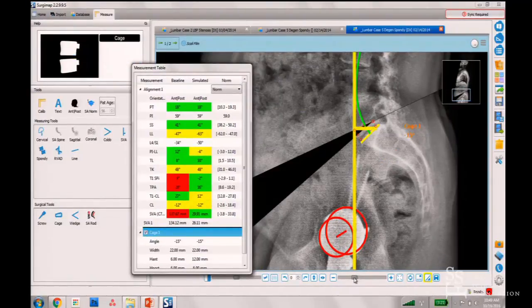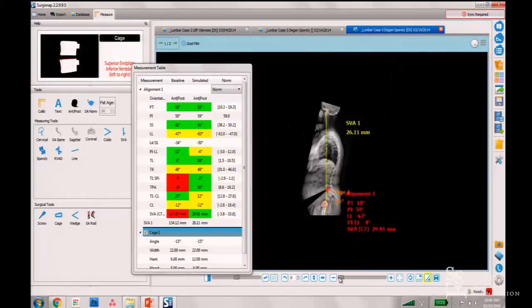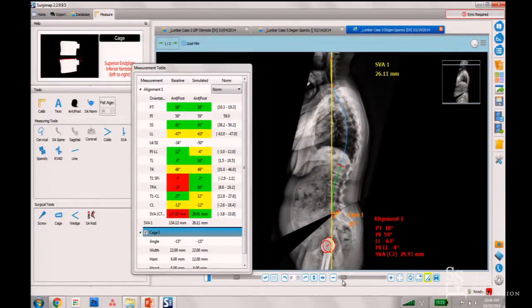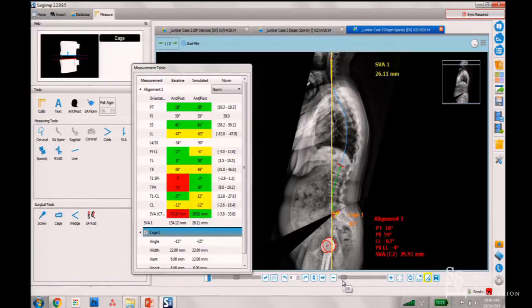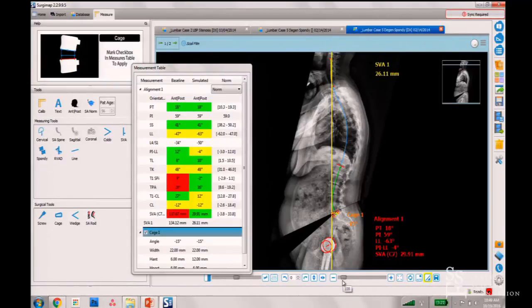I put in a pretty big cage — it's a numerical simulation, so I have no complications. I think this is incredible, but we have to cut the data.